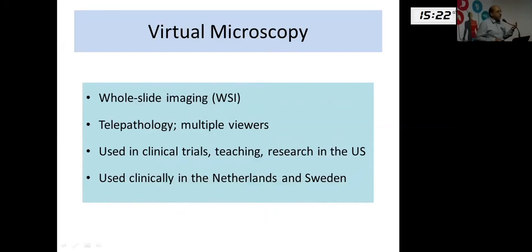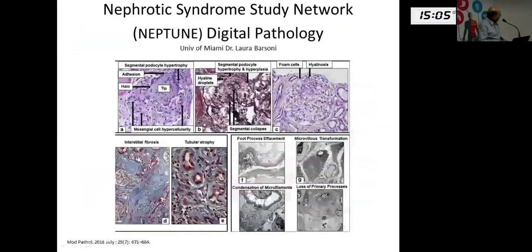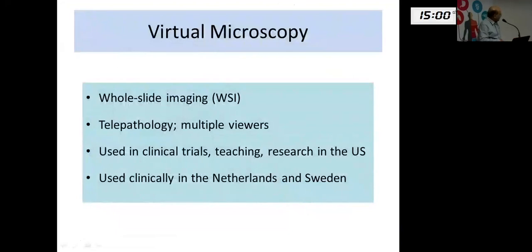The similar technology is used by hematologists for various karyotyping and other studies, as well as in neurology. There was 10 years ago an attempt at getting one of those microscopes for our purposes. So whole slide imaging is possible. Telepathology sends it around. Multiple students can view the slides, and they're used in trials, teaching, and research in the US, while Scandinavians are usually one step ahead, and they use it clinically in both Netherlands and Sweden. Regular stuff.